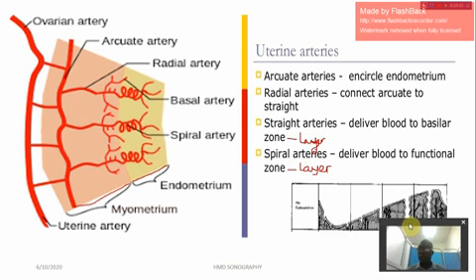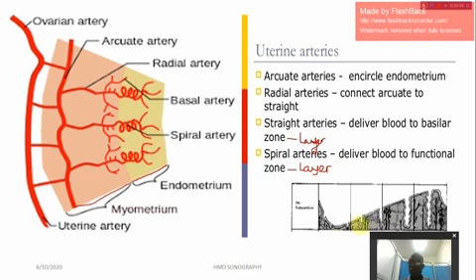So you can see the pictorial view of what they have depicted here. It's a gradual growth of the endometrium. This is the endometrium, so you can see the blood vessels, the lacunae, the blood vessels from the estrogen. This is the estrogen level, here to progesterone. So from here, climbing up, those graduated peak is the progesterone level.